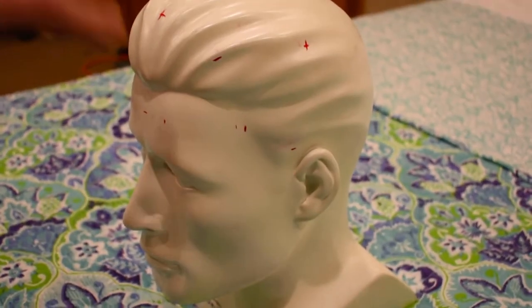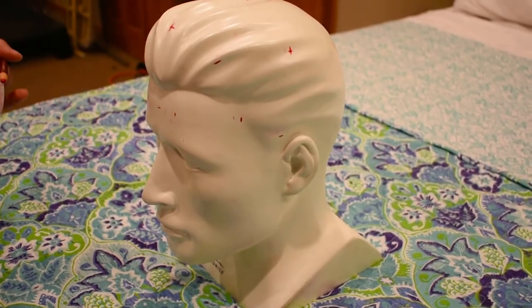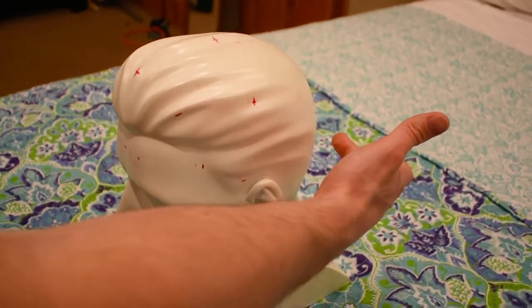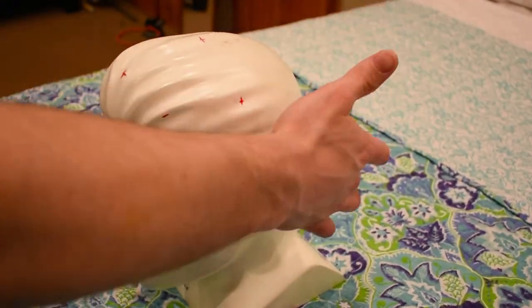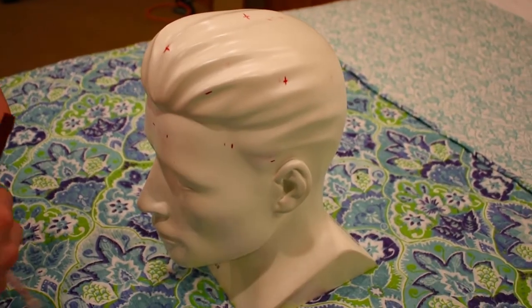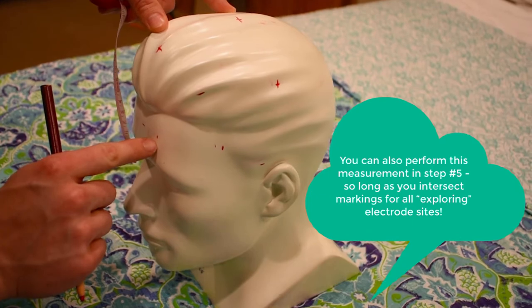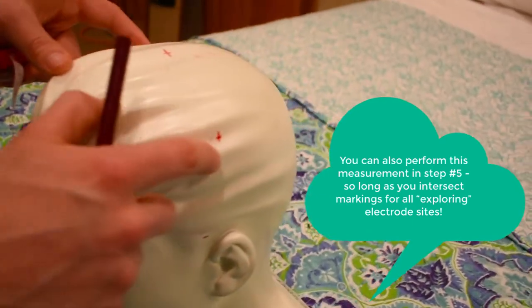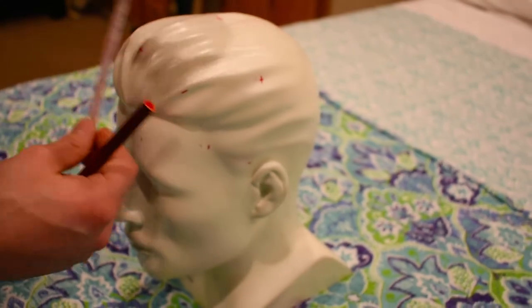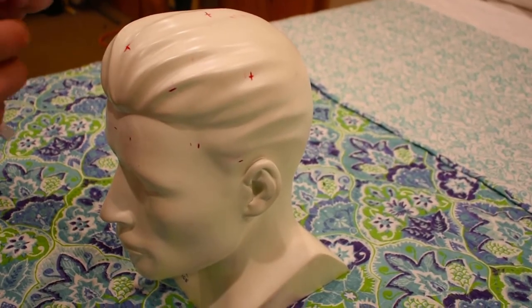Okay, so the final measurements that we have to make for our F's are going to be the same thing: FP1 back through to O1, and FP2 back through to O2. We know the distance between our FP's and our C's is 13 centimeters. So we just measure halfway between that distance, which is 6.5 centimeters.